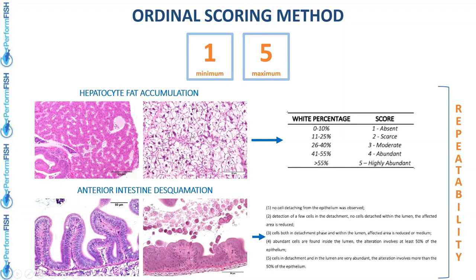In a specific area, we calculate by image analysis software the white percentage, and then we find the correct range for the score.